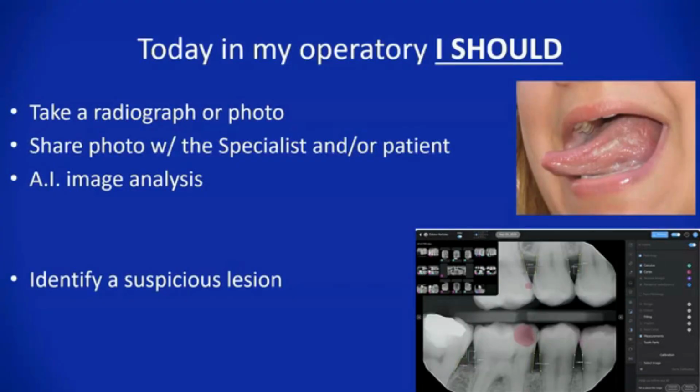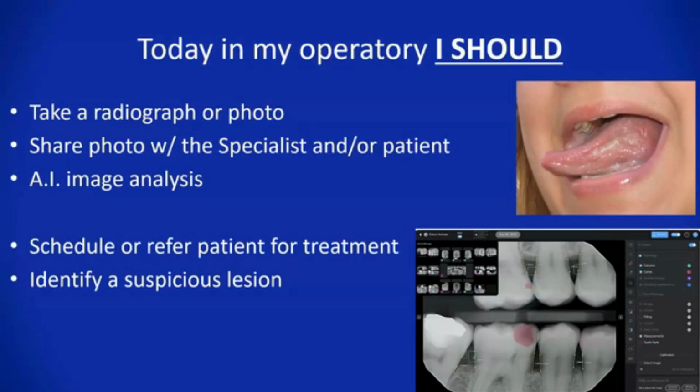Photos I can share with a specialist now. I do this in my office right now. At least 2 of the 5 specialists that I work with on a regular basis have direct access into their practice management system, where I can send an image and say, hey, can we chat about this? And usually within 5 or 10 minutes, I can have communication with them about what they think about it. Very helpful. Right then and there, I can schedule a patient for treatment. If I'm going to do something about this, I can schedule it right there. If the specialist is going to, we can do that in the treatment room.